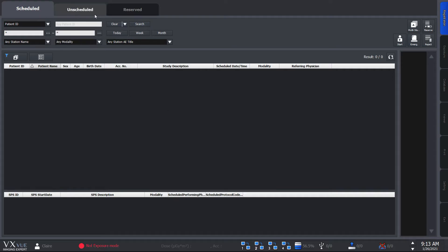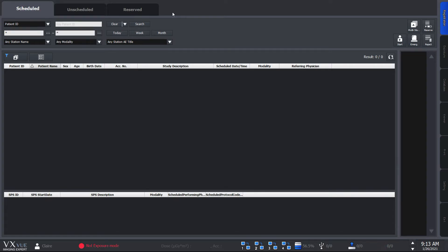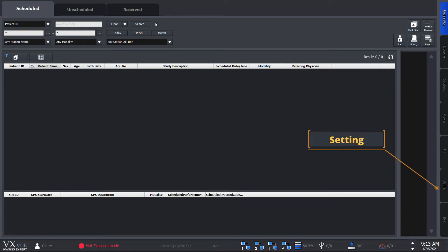So this is what you'll see first when you log into VXView. We have the scheduled, unscheduled, and reserved panels on the top. Now the three panels each indicate different patient registration types that you use. So you can choose a panel type depending on how you register your patient information or demographics. You can set which panel to show first at the setting mode.